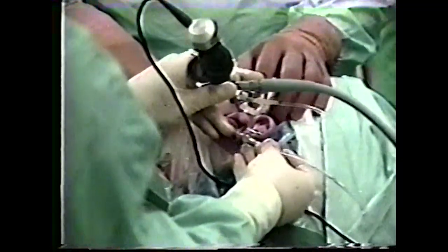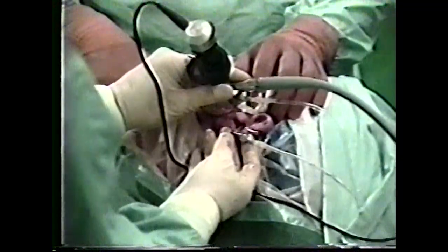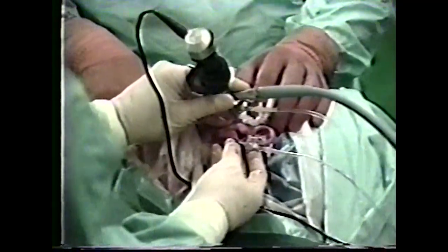Remember to attach the outflow tube to the endaural cannula and reconfirm through and through lavage.